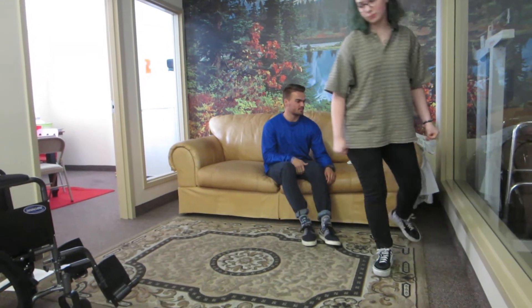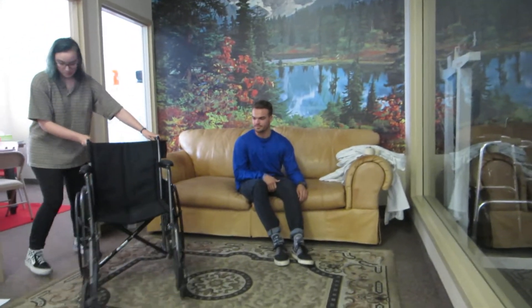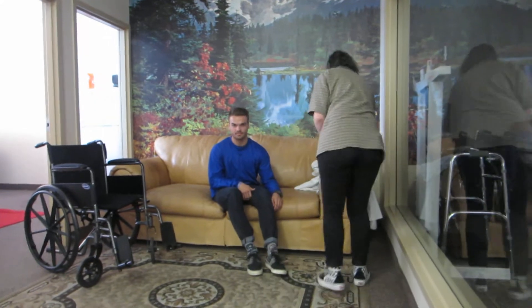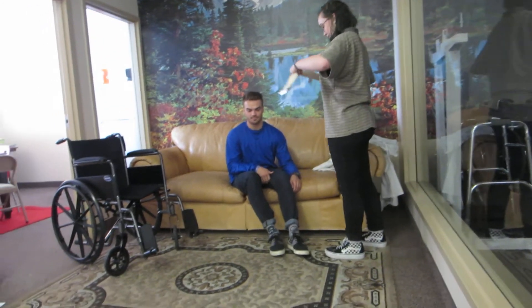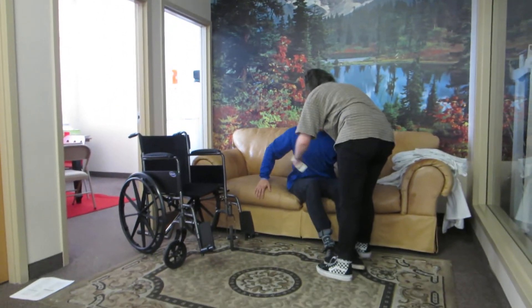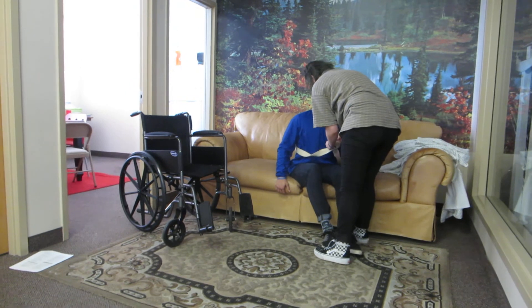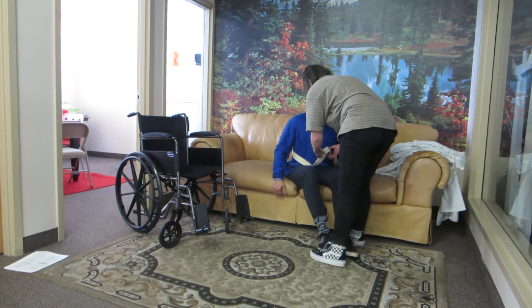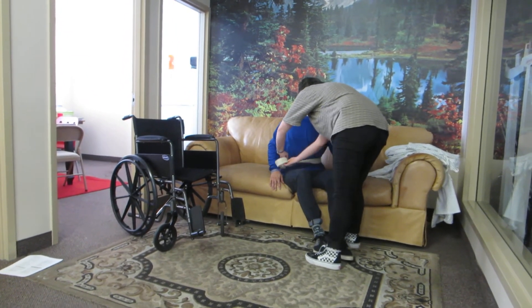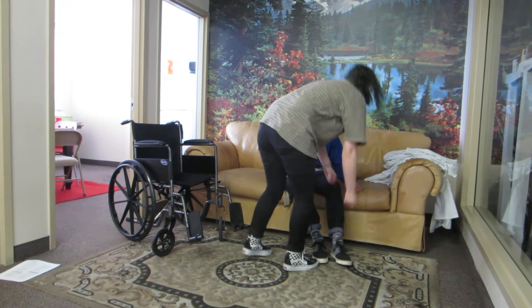That is locked. Okay, and we're going to use the gait belt. We're going to put your shoes on.